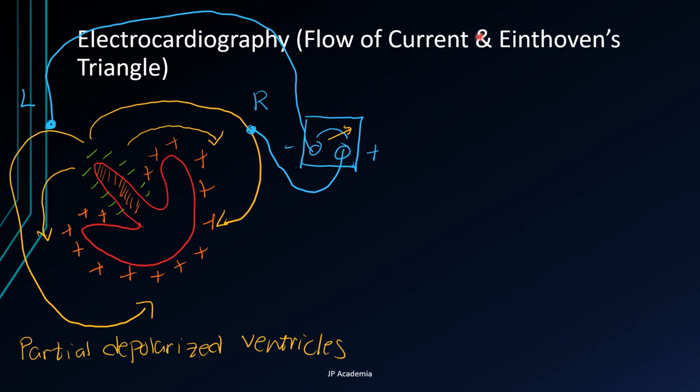When one part of the ventricles depolarizes, it becomes electronegative relative to the remaining parts as shown here. Electrical current flows from the depolarized area, this one, to the polarized area. So these yellow curves show the current flows. Note that the impulse arrives first in the septum of the ventricle before it spreads to the inside surface of the ventricles.